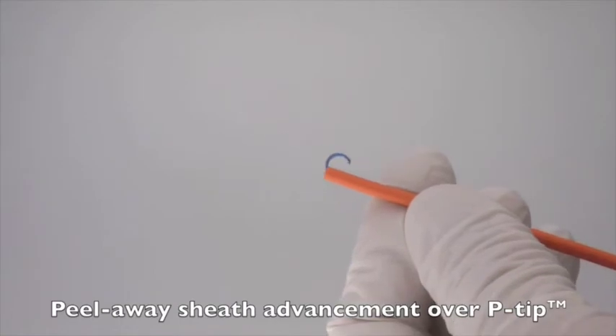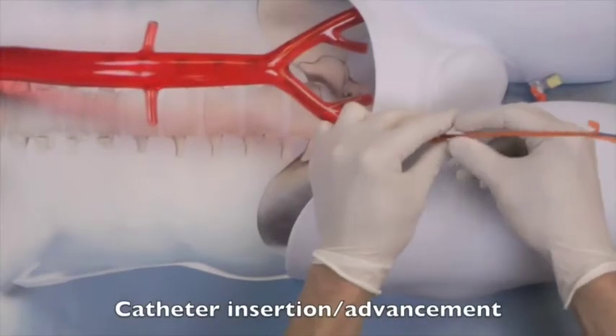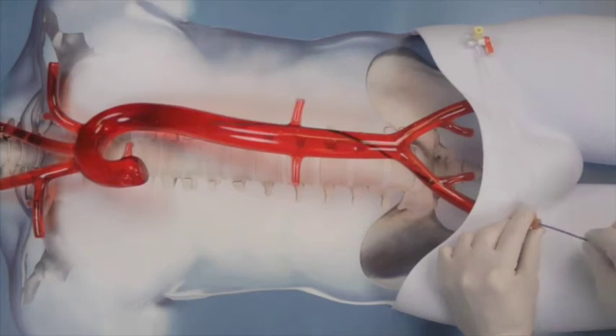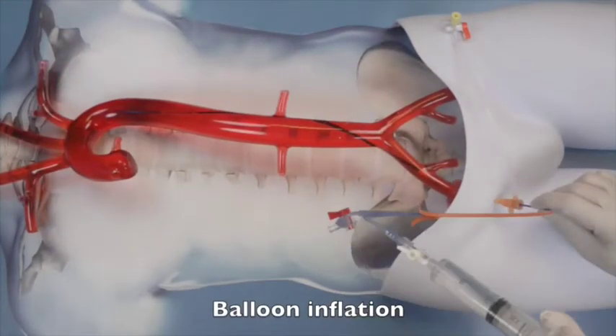I place the device itself first, flushing the balloon to test integrity, advancing the orange peel-away sheath over the atraumatic tip, and flushing the A-line. The orange tip is engaged to the valve of the sheath and the actual blue shaft of the catheter advanced into the aorta to the pre-measured position, which I've determined with external measurements.